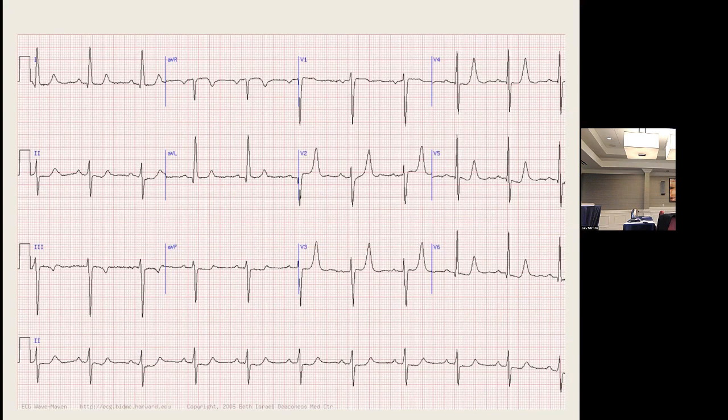Okay. Everyone loves to see hyperkalemia on EKGs. You almost never see it. It's specific, but not sensitive. But when the repolarization peaks well above the QRS, you better be thinking serious hyperkalemia. These are the kind that go into cardiac arrhythmias. Okay. So you'll see patients with CKD, and their potassium's 5.6, 6.1. The EKG doesn't show anything. But when it's 6.8, it's going to show something. And that's the case here.